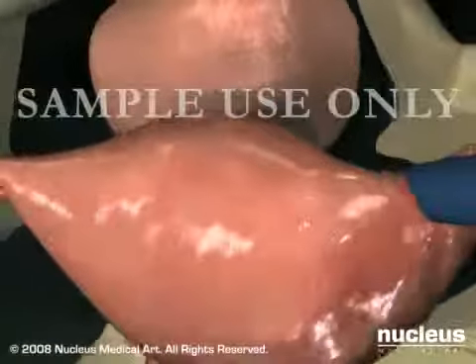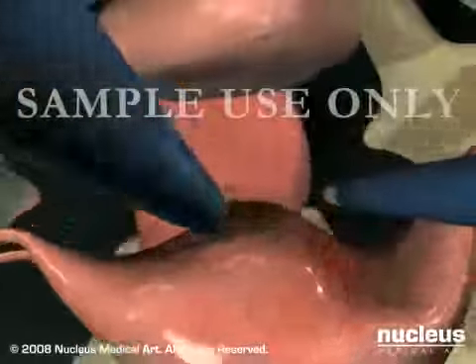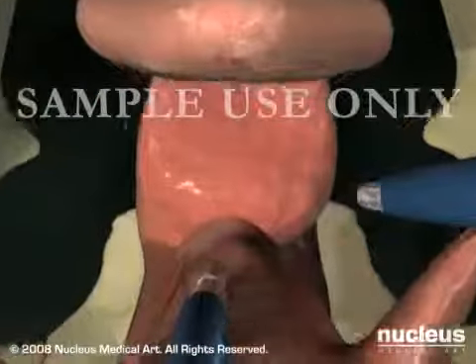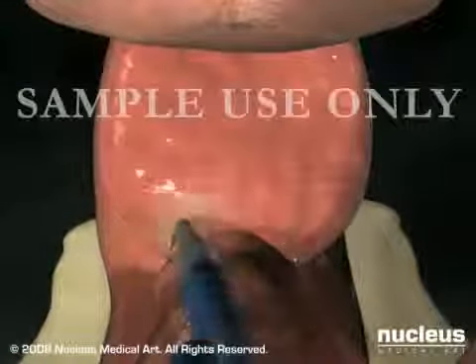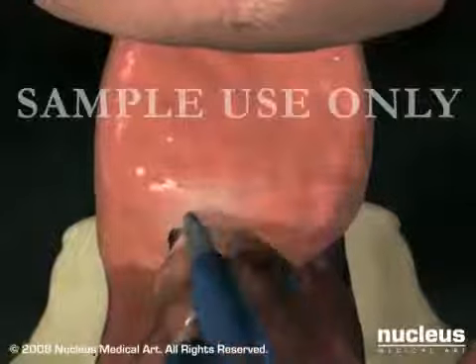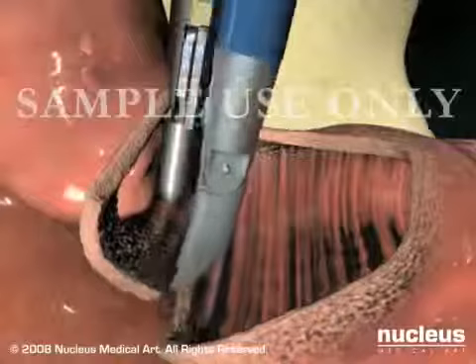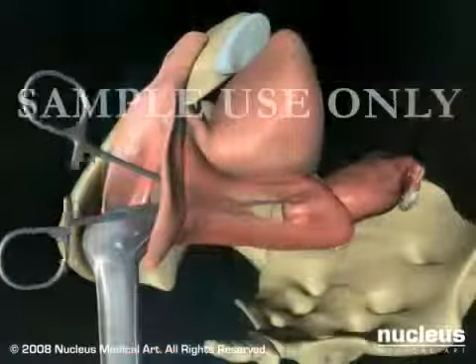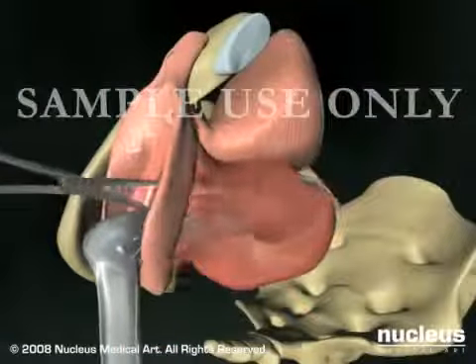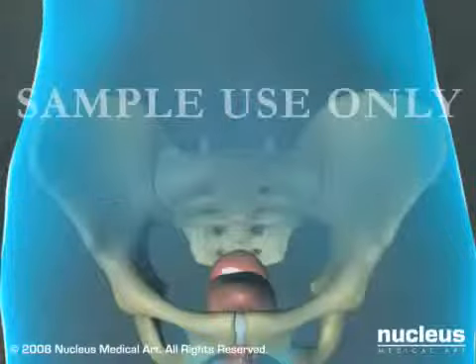Watching on the monitor, your surgeon will slip specialized surgical tools through the other ports and use them to make an incision around the cervix, cut the uterus free from its supporting ligaments and tissues, and pass it out through the vagina. A laparoscope can also be used for a salpingo-oophorectomy. Finally, your surgeon will close the incisions on your abdomen with stitches.